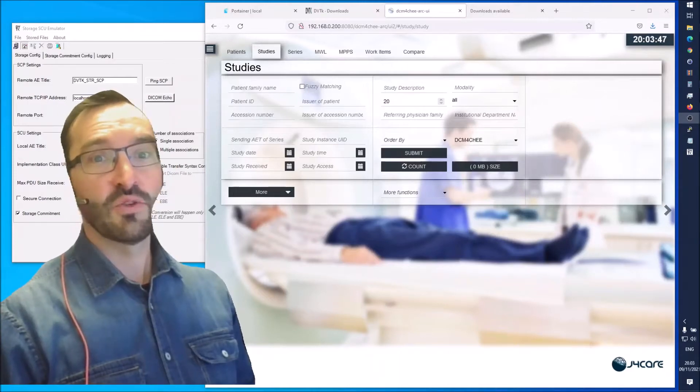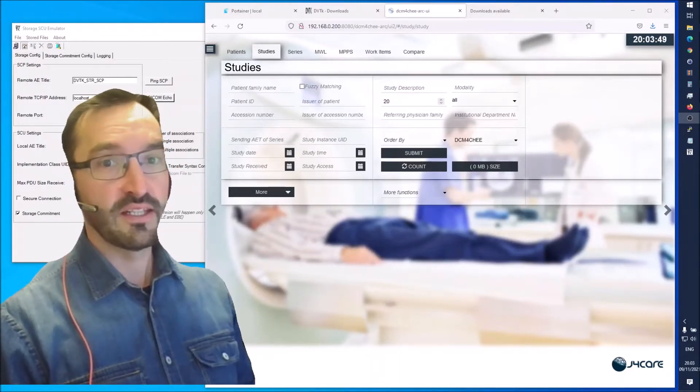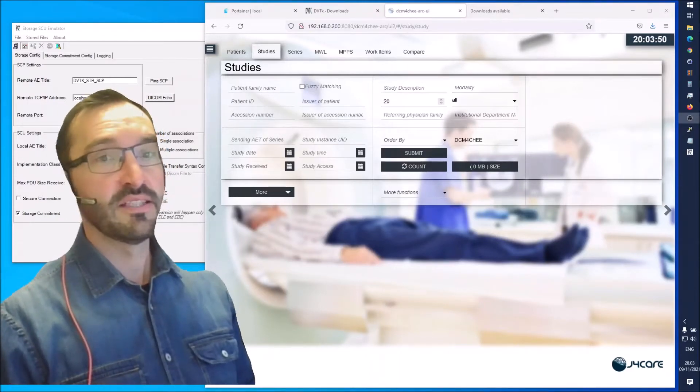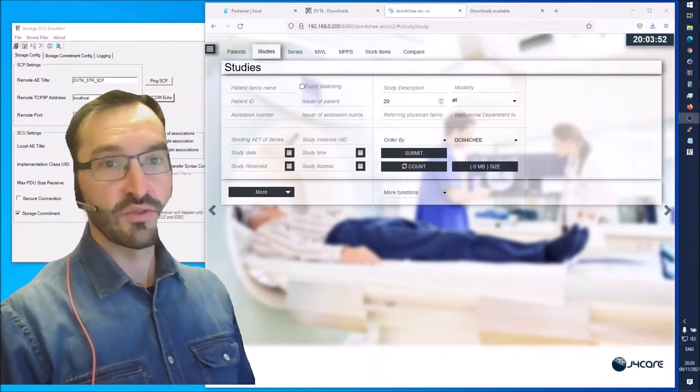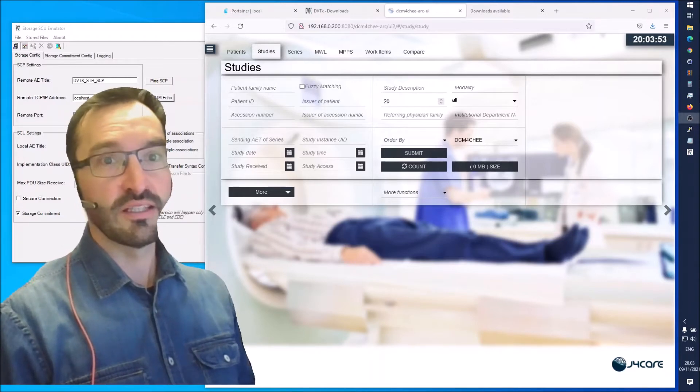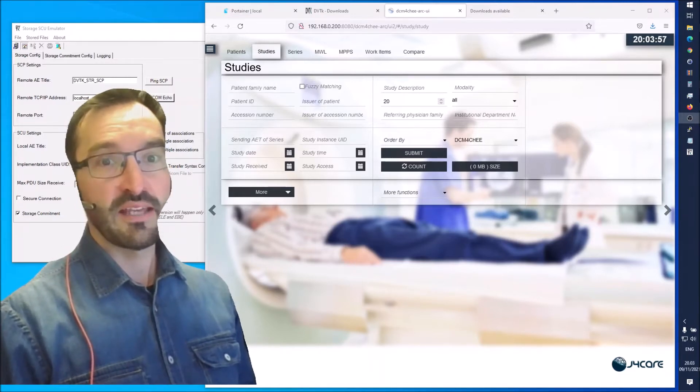Hey guys, in the last video we installed the Daikon4G VNA. In this video we will be sending some studies to it using the storage SCU emulator from DVTK.